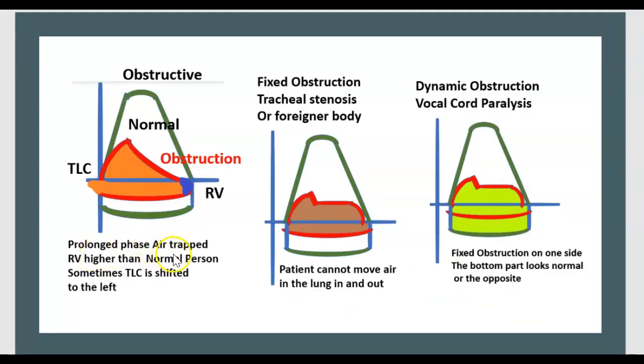Obstructive, prolonged phase, air trapped. Fixed obstructive, patient cannot move air. Dynamic obstruction, vocal cord paralysis. Fixed obstruction on one side and normal on the other side.